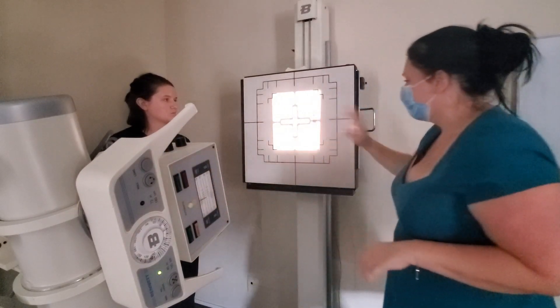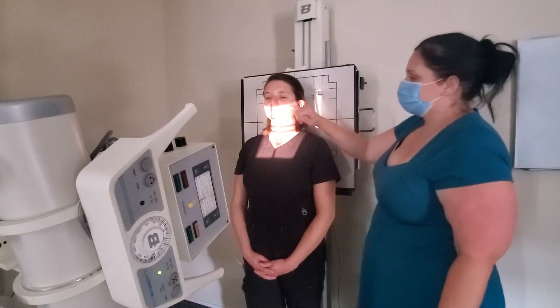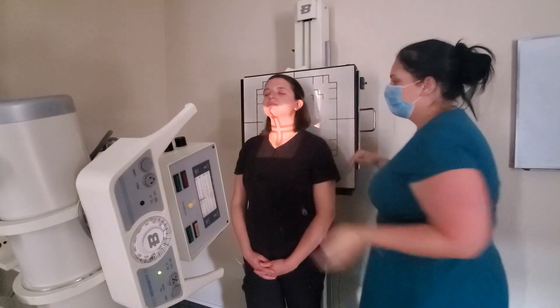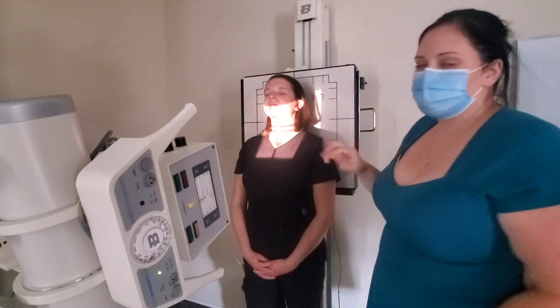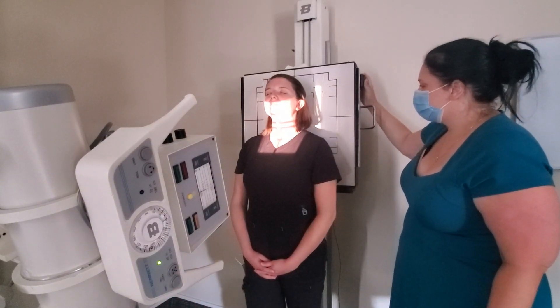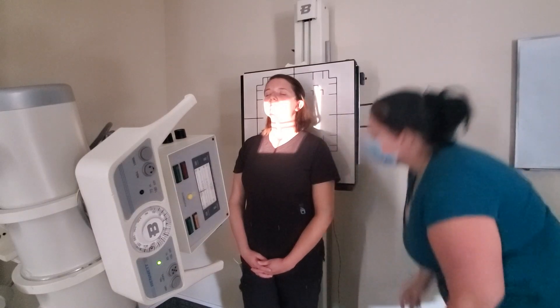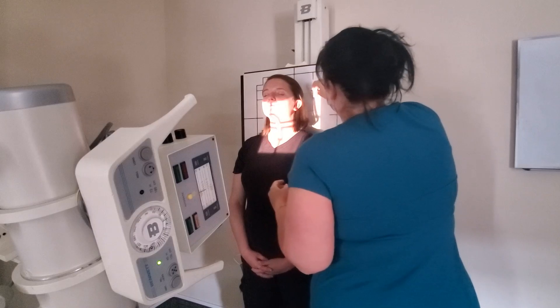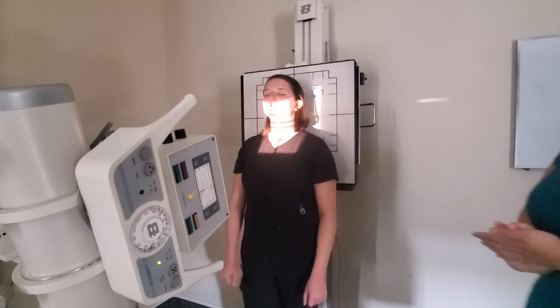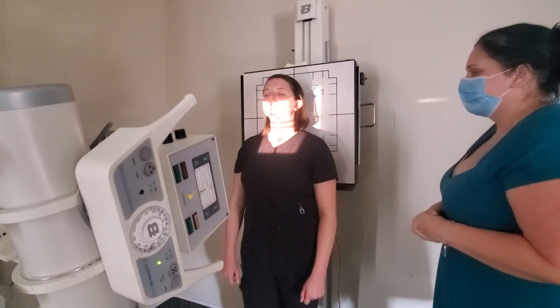For this image, centering is at C4. You also need your AML — which is right below the nose to your EAM — perpendicular to the IR. I'm going to have her elevate her chin slightly to get that line perpendicular, centering approximately at the Adam's apple area which is C4. Touch the tube, touch the bucky. 40 inch SID, 15 to 20 degrees cephalic, AML perpendicular to the IR, centering at C4 with a 10 by 12 lengthwise cassette — that is your AP axial C-spine.